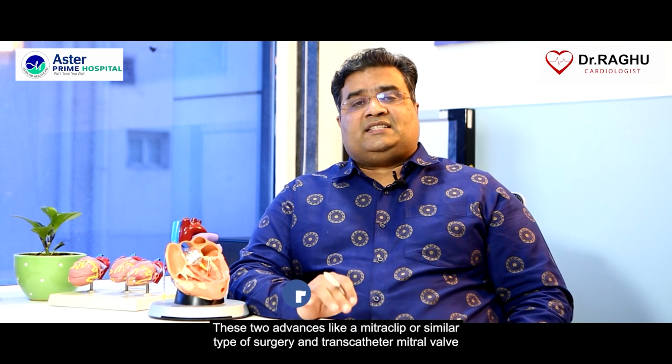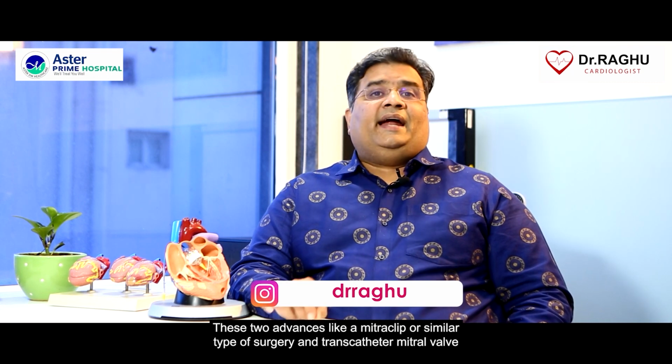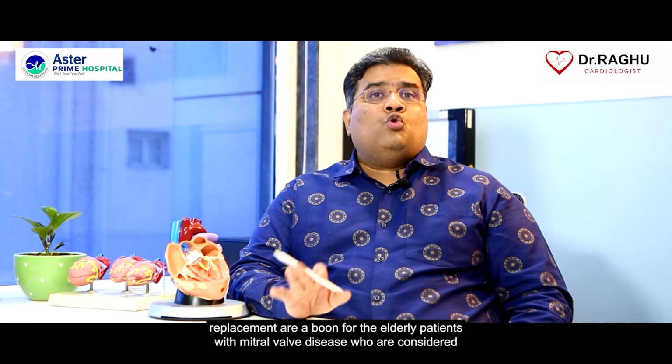These two advances, like MitraClip and transcatheter mitral valve replacement, are a boon for elderly patients with mitral valve disease who are considered not suitable candidates for mitral valve replacement surgery. This is an important advance in those patients with end stage heart failure and a leaking of the mitral valve.